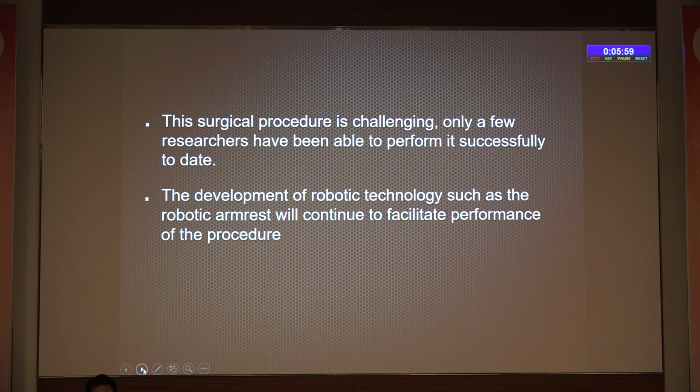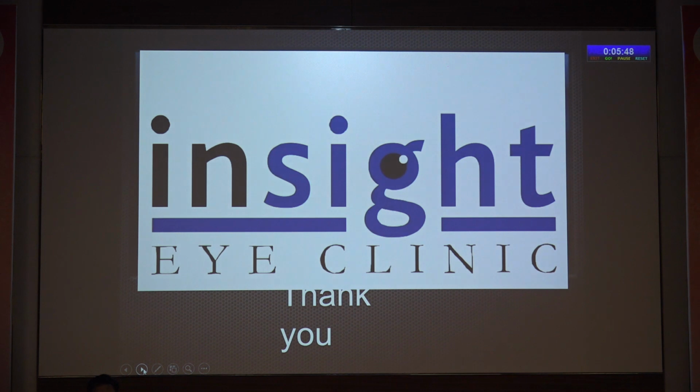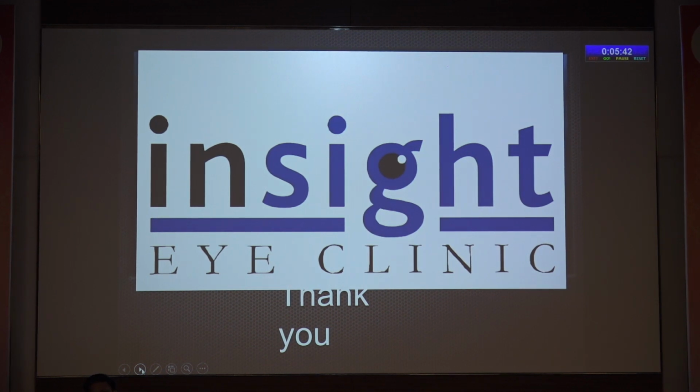So to summarize, this surgical procedure is challenging, and there are a lot of challenges. Of course, in the future you would need robotic technology with an armrest if you're going to have such a fine needle piercing exactly into the central retinal artery. So the future of central retinal artery surgery is definitely there. Till then, we can do whatever is in our hands, like trying to massage the central retinal artery, or doing a low hypotonic vitrectomy and dislodging the embolus, the way I have done in a few of my cases. Thank you. Thank you very much.